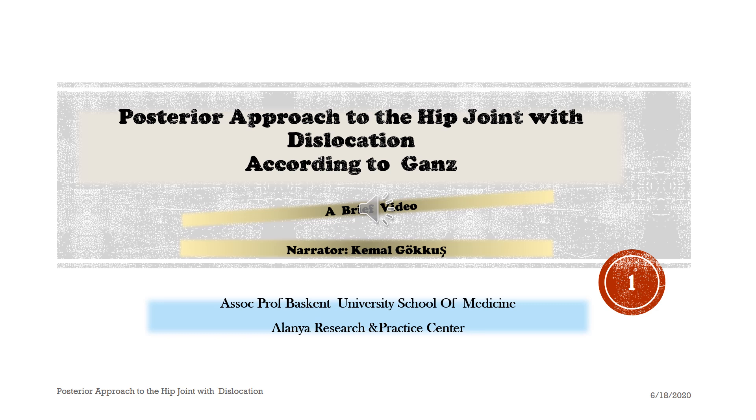Posterior approach to the hip joint with dislocation according to the Ganz technique — a brief video.